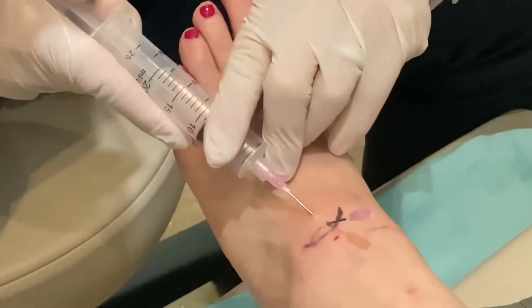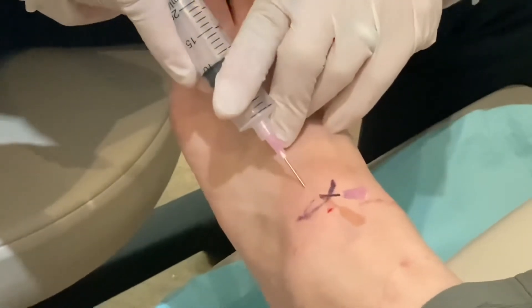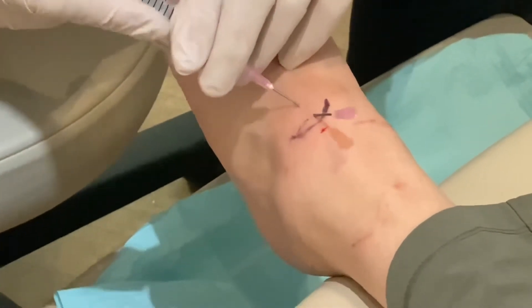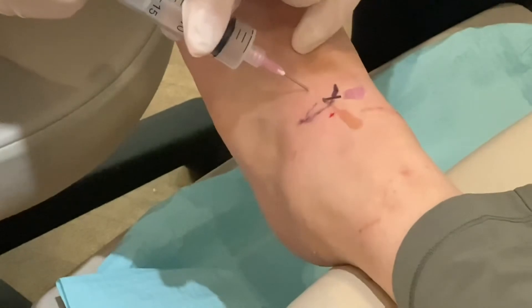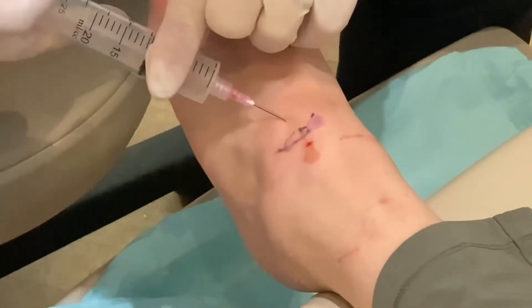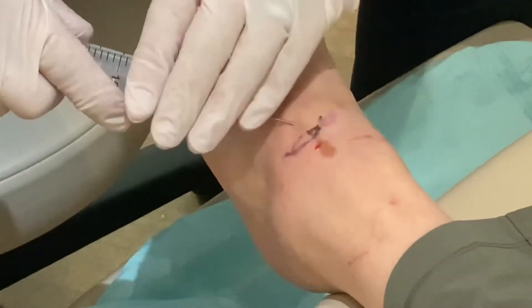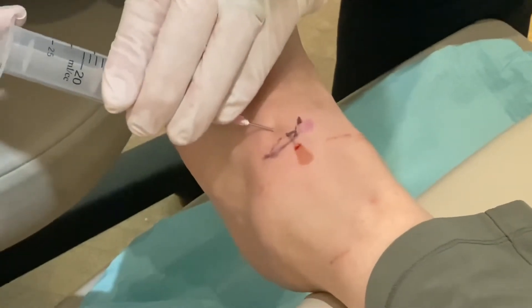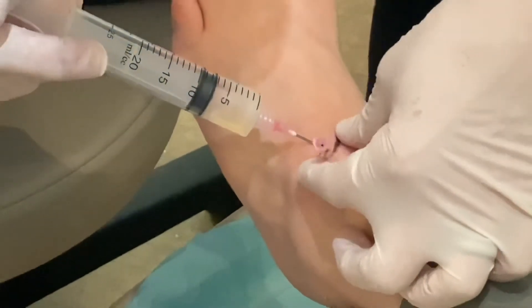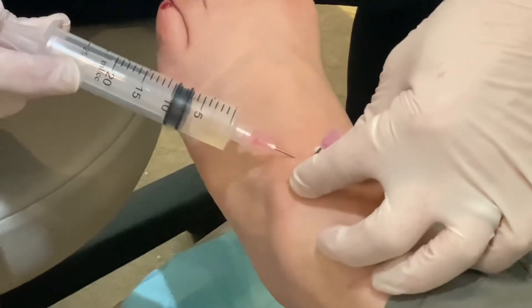Now you're going to feel a lot of shaking as I try to get some fluid out of here. Sorry if I'm pushing on your foot too much there. How are you doing? Just fine. Am I hurting you? I just feel the pressure, but that's fine.